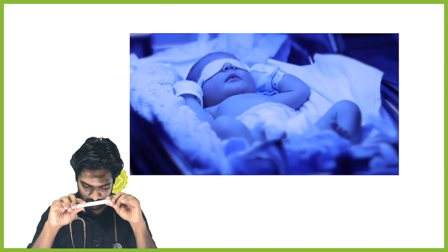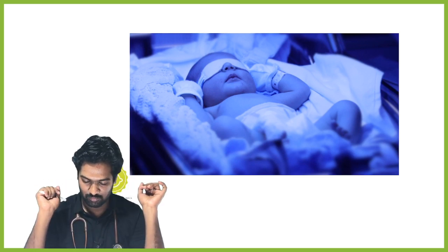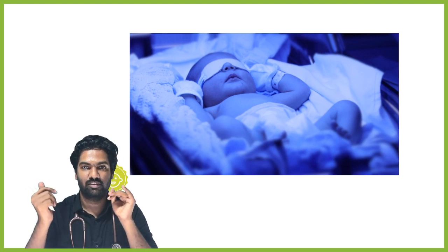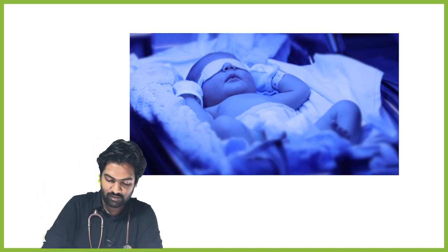Fine, guys. Come on. What is this now? Why do you see that it is such a bluish color screen? Eyes closed. What is this? Phototherapy unit.